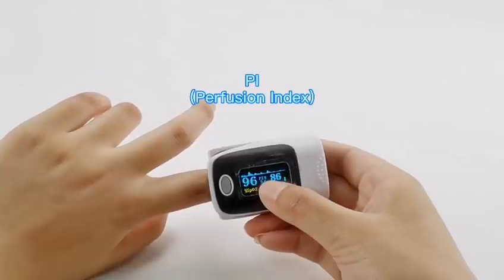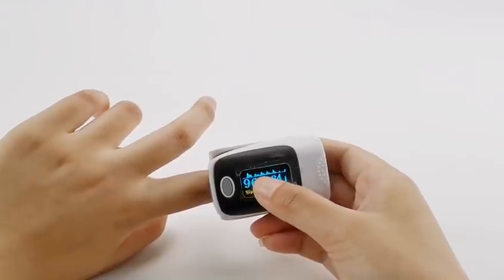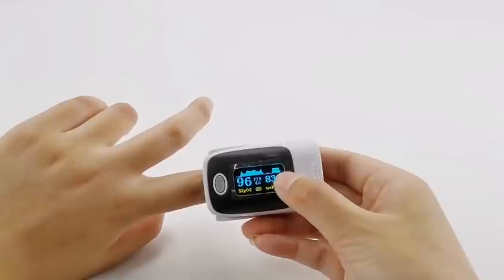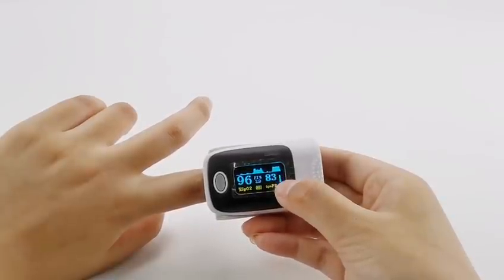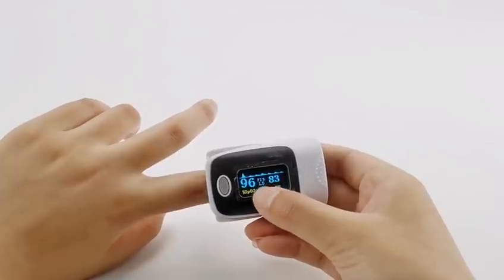In the middle is the Perfusion Index, which tells you the strength of your Pulse Rate. The waveform on the top is a visual representation of your heart's activity over the last 5 seconds. The blue bar on the right fluctuates with your pulse to give you a visual image of your heartbeat.